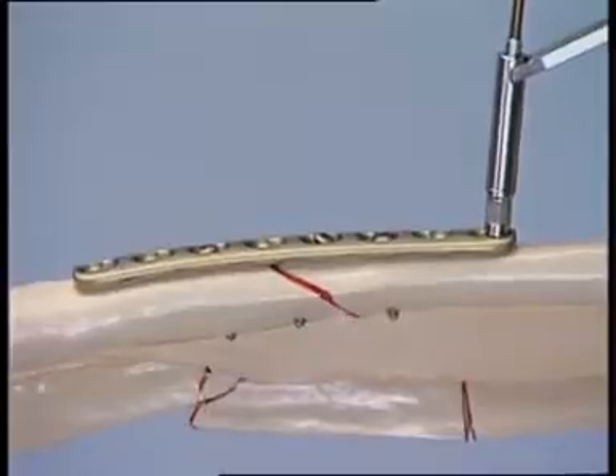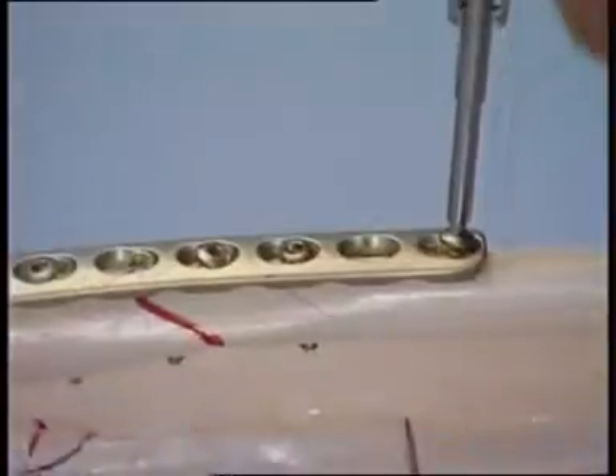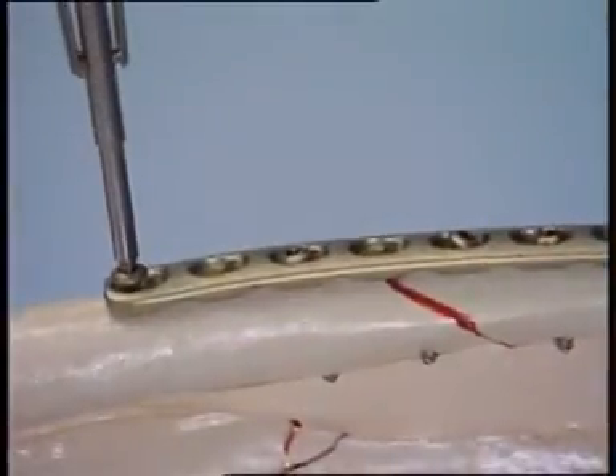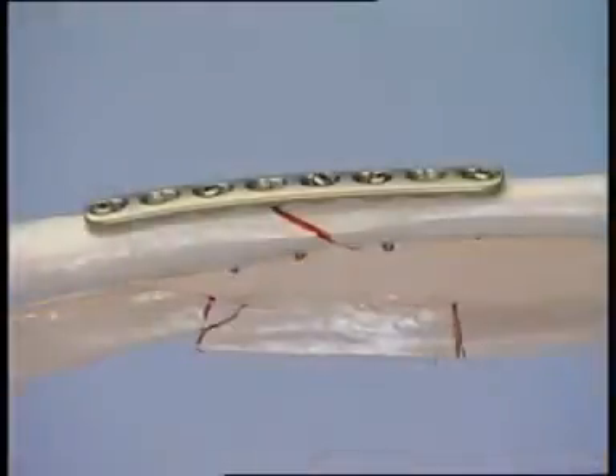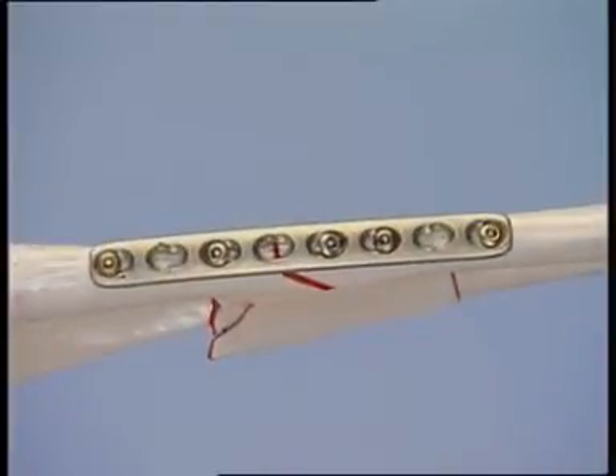To supplement this fixation, another 3.5 mm cortex screw is added at either end of the plate. The 5 screws should provide sufficient stability in normal bone, although in the case of poor bone, all the plate holes apart from the hole over the fracture should be filled.